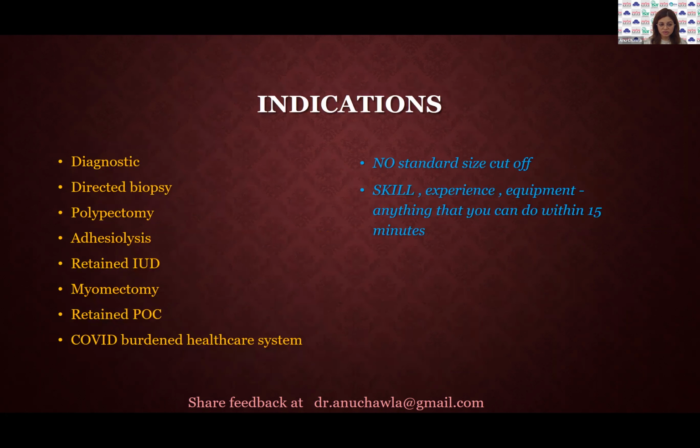The indications. Especially when we are transitioning and just starting to do it without anesthesia, we can start by doing the diagnostic ones. Especially these days, we have handheld, portable, mechanical instruments, without any electrosurgery, without any separate light source. Those kinds of diagnostic procedures or directed biopsies are at least the procedures that you can begin with, and then you can do the rest of them mentioned in the list.